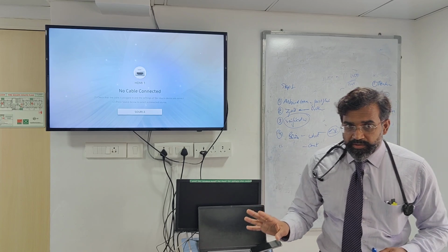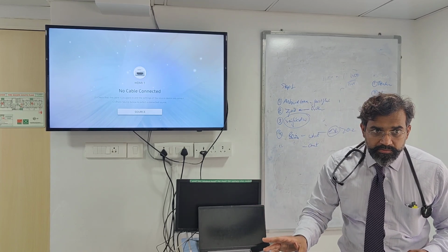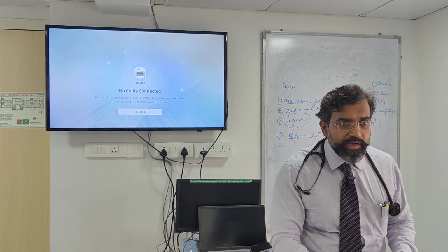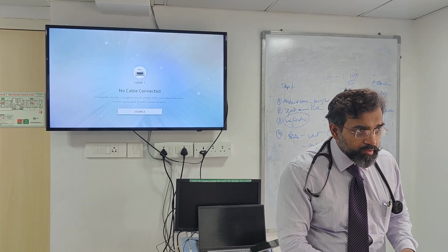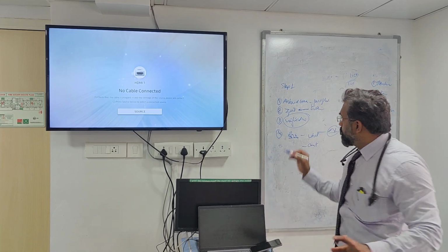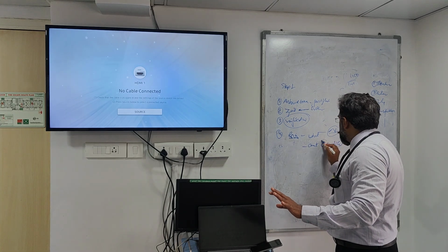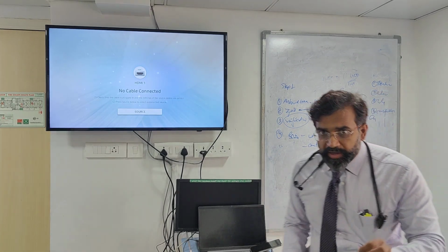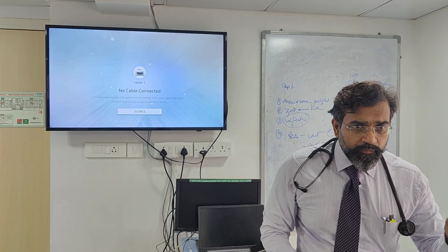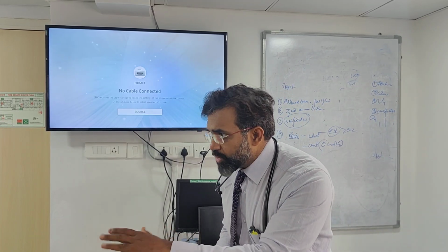According to body weight, listen very carefully. Irrespective of what your amount of fluid is, if I'm going to do it in pediatrics, 20 ml in a neonate will kill the patient baby. So it is 0.2 ml a kilogram. If you ask me exactly how much, it is 0.1. But in an average adult, you can use anywhere between 15 to 20 ml of this, and in fact higher also. I'll tell you why.